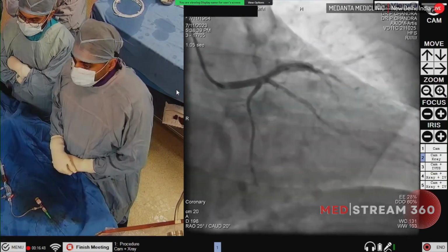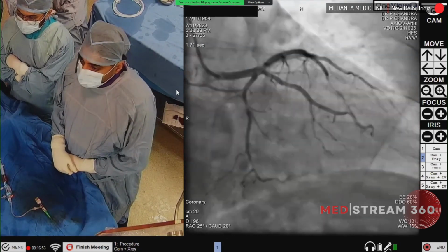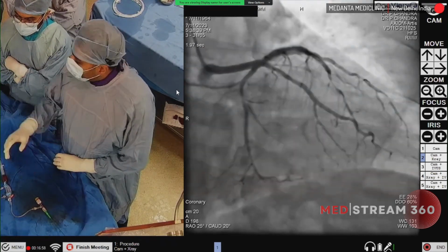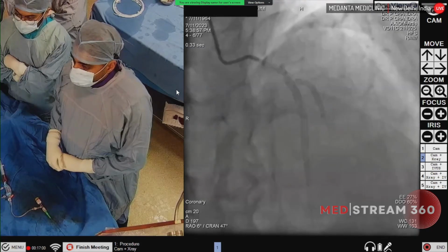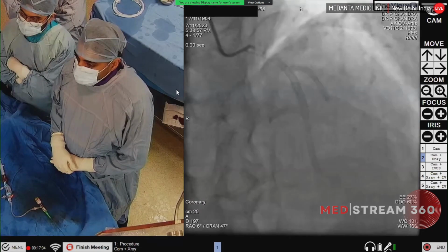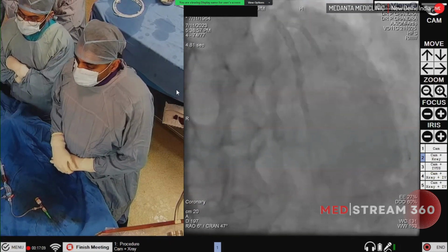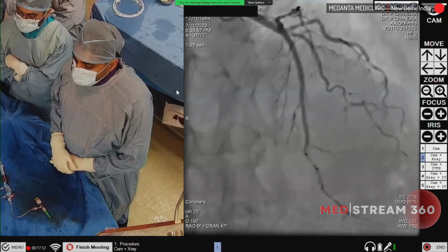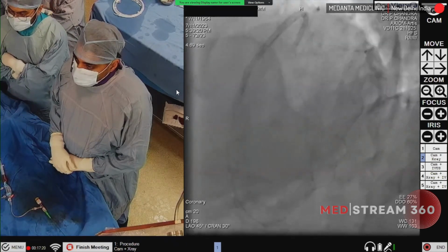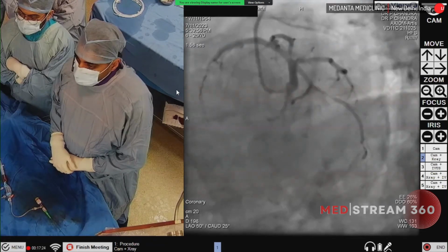So angiography was done the day before yesterday, which revealed patent stents in LAD and diagonal with a very good flow in both the stents and minimal restenosis. Next slide. So this is the long LAD stent with the diagonal stent at the bifurcation, which is very well flowing. The LAD distally has an approximate 90% distal lesion. So this is the cranial view, which is also showing a good flow in the stents with a minimal restenosis.